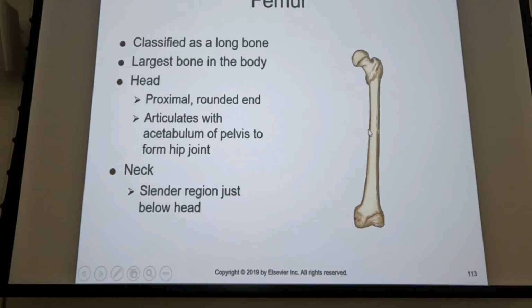If we have a patient who has a mid-shaft fracture of the femur or the tibia, either one, your repair of that fracture might involve what we refer to as an intramedullary rod. So what they do is they go in and hollow out the medullary cavity. It's just like a flexible drill with a great big head that just goes in there and destroys all that fatty marrow, and they drive a rod down inside the medullary cavity to join the two pieces back together again. They'll put screws at the proximal and distal end to hold everything together.